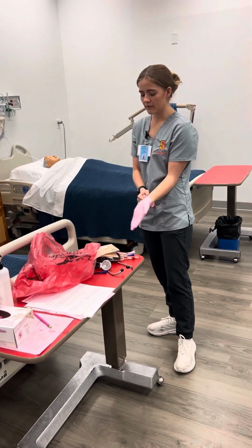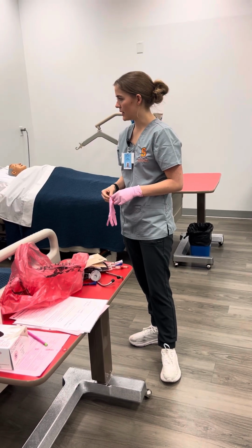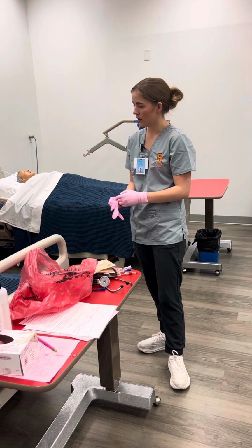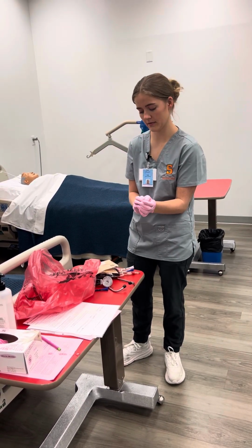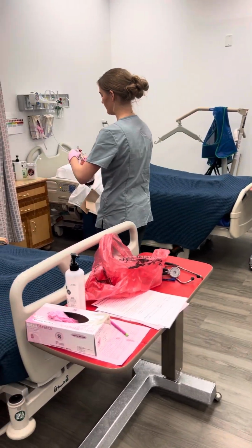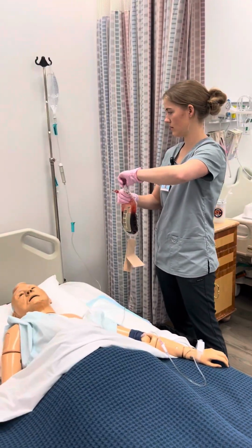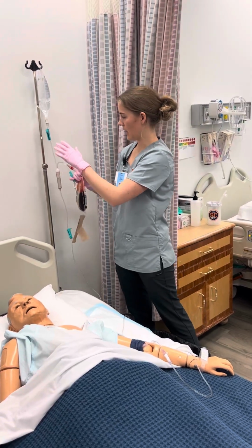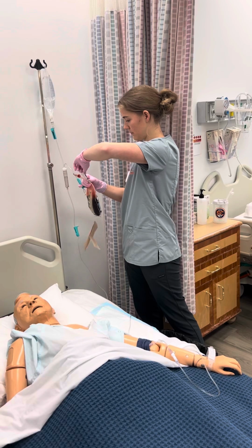And if my patient experiences any reactions with this, I'm going to make sure to stop the transfusion and change out the tubing, flush it with saline, notify the provider, and then send the blood back. And then my line is already primed, should be good to go.